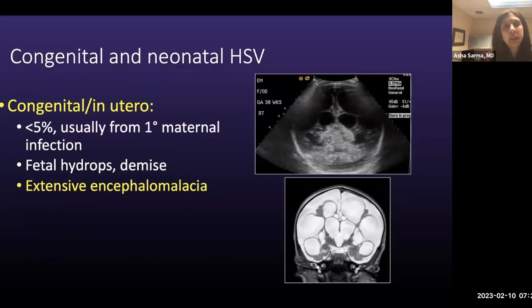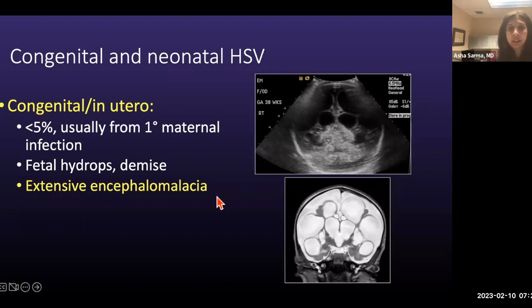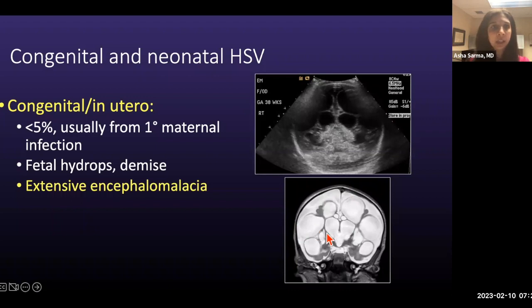Congenital and neonatal HSV infections are pretty rare, representing less than 5%, and are usually from primary maternal infection. They may result in fetal hydrops or demise, especially earlier in gestation. Patients affected in the third trimester may have extensive encephalomalacia. Here is a zero-day-old term infant with congenital HSV infection showing extensive encephalomalacia in both cerebral hemispheres, ventriculomegaly, ex-vacuo dilatation of ventricles, and enlargement of the subarachnoid spaces — very devastating.